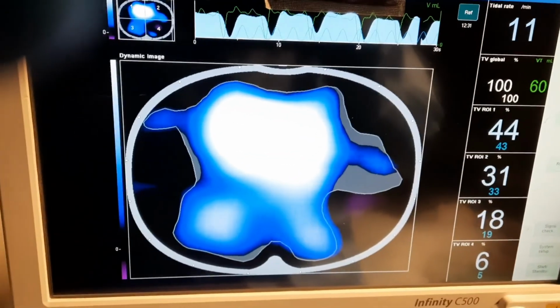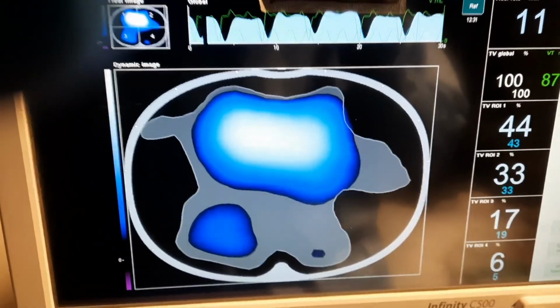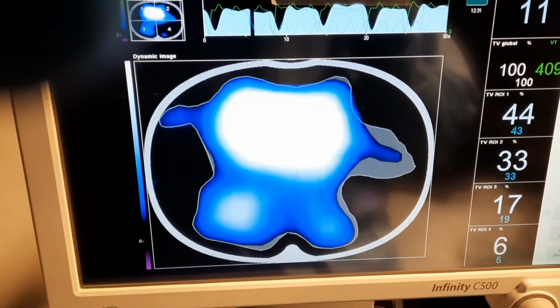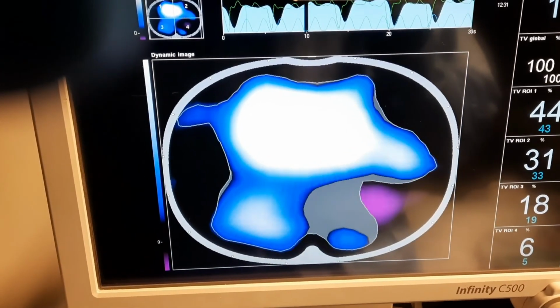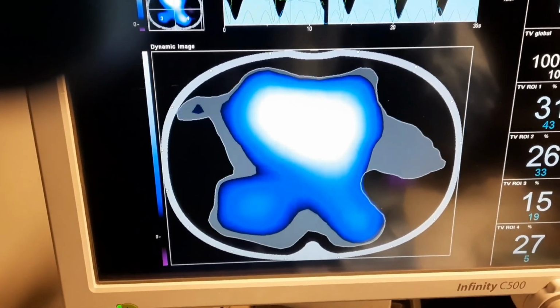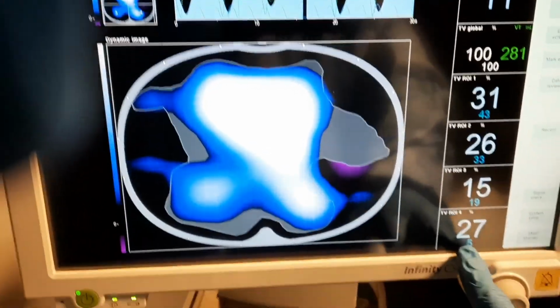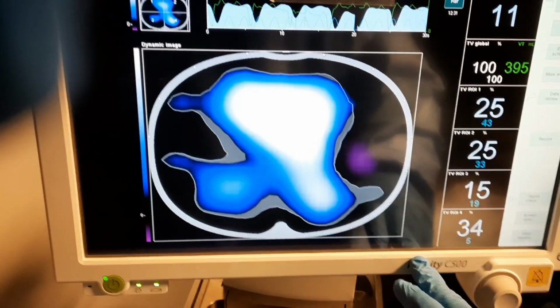Okay, that's it. I'm not going to keep the patient on APRV, but I might talk to the doctor and ask if we paralyze him and try APRV, maybe this could work a little bit more. It's worth a trial. APRV takes some time. Sometimes you might get the benefit that's sustained, like we're seeing here, but it might take a couple of hours. Almost a whole shift.